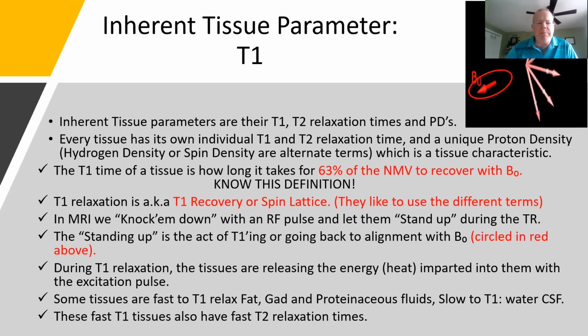And I'll bet you another cup of coffee, they're probably going to throw in the term spin lattice at you somewhere. T1, spin lattice, T1, they're the same, tomatoes, tomatoes. So in MRI, this is how I like to teach it.